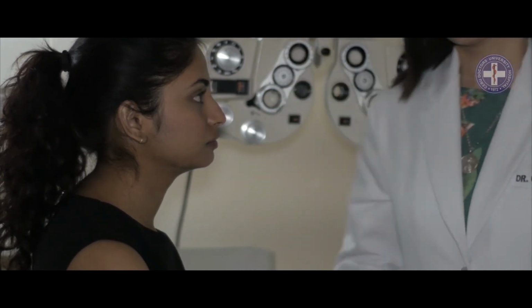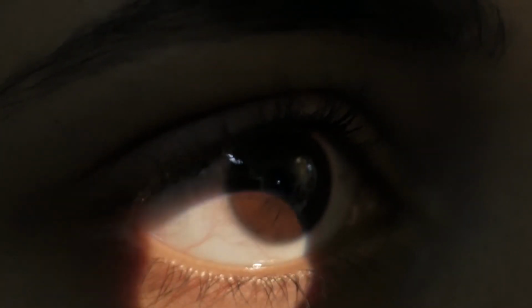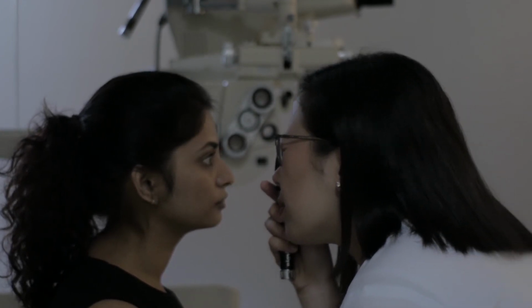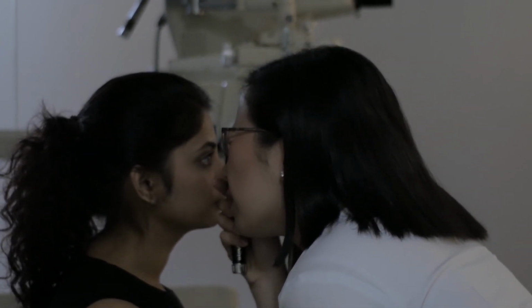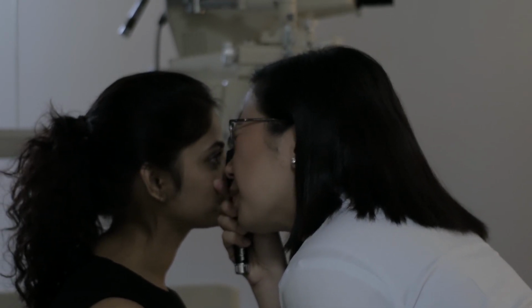Now let us begin with the right eye. From a position of 15 inches away from the patient, shine the light beam on the right pupil. Find and follow the red-orange reflex. Once the red-orange reflex is obtained, gradually move the ophthalmoscope closer to the patient's eye, almost touching the patient's eyelashes.